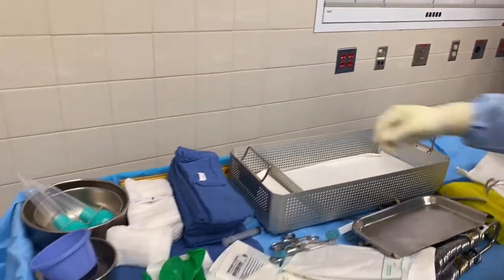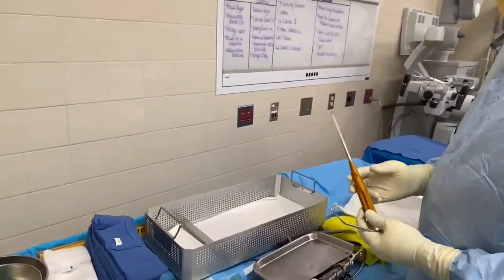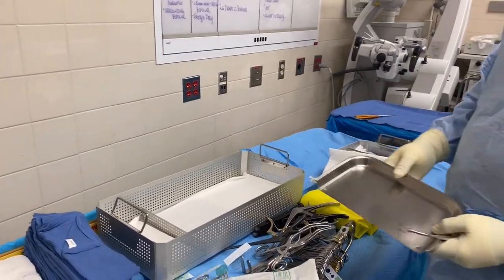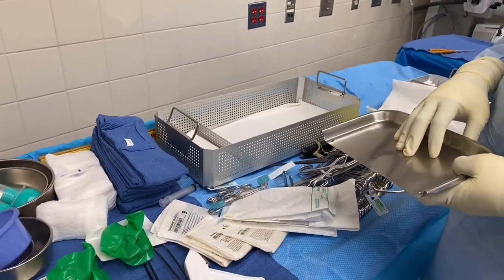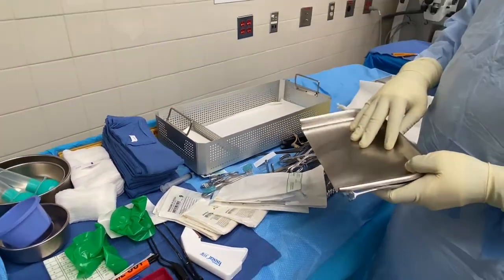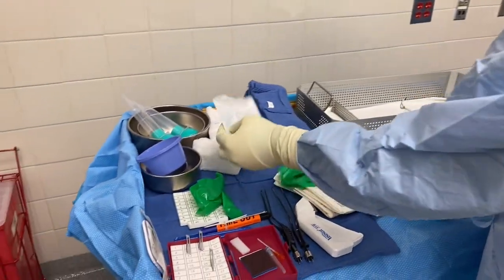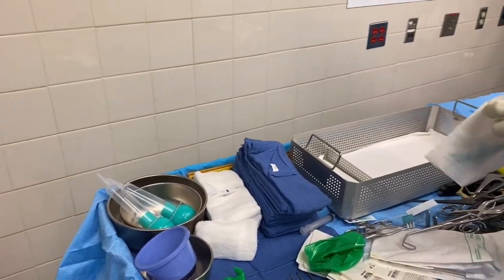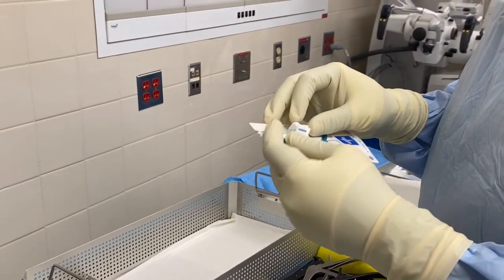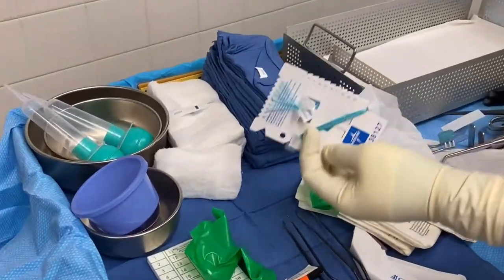This is a basic craniotomy set. This is a patty tray — that's why we put the one-by-one patties here. Some doctors want them moist, some want them dry, so usually we don't wet them until the doctor says so. The patties are the cottonoids — some people call them patties, some places call them cottonoids. The size is half by half.